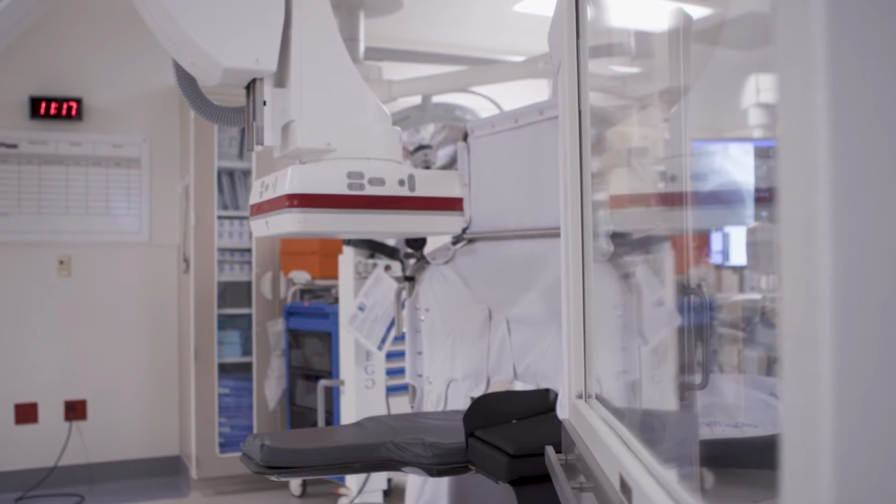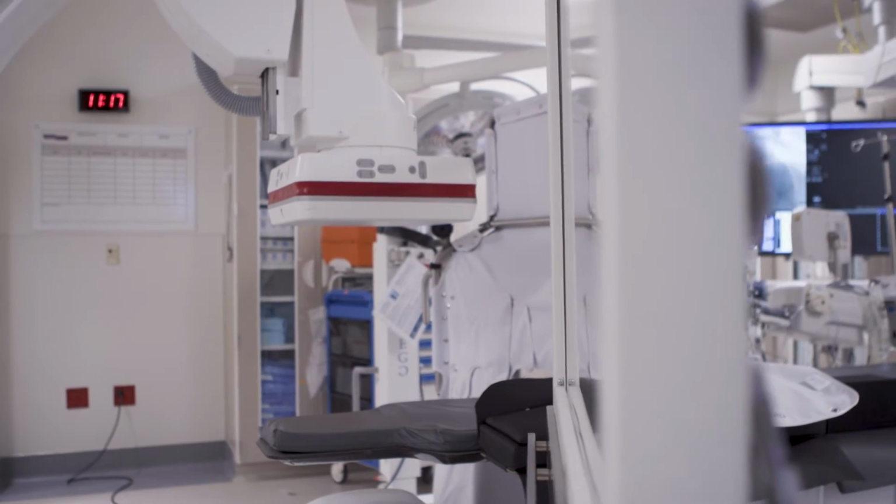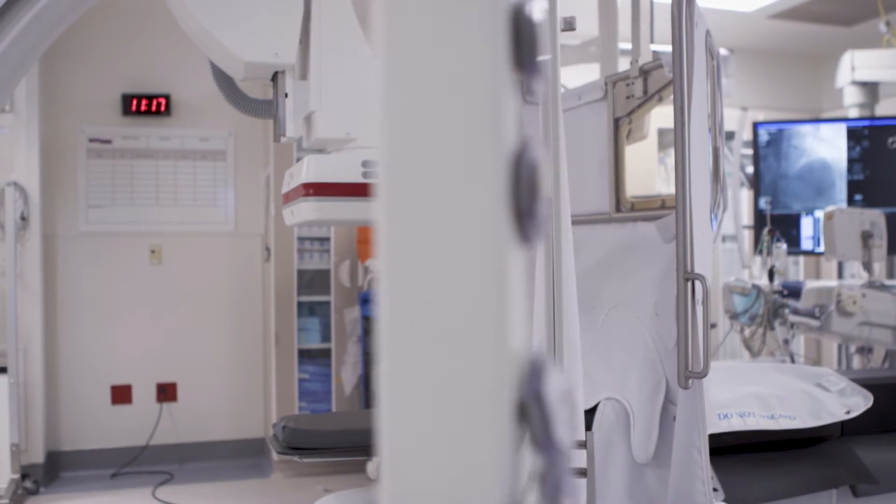We have been doing that for years, and we have some shielding to block it, but you put radiation badges up on the collar and that's what you're going to get. You're going to get around 2 millirem during a case. That's a real case, and that's going to go to your head. It's an area that needed to have attention paid to it and technology to advance it.